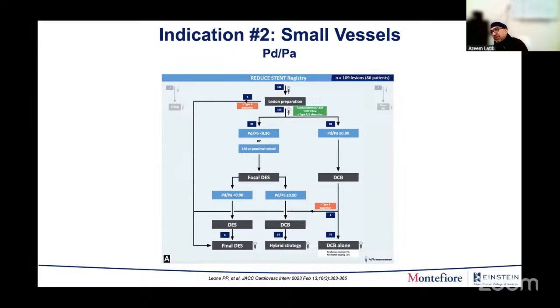The big challenge for us is it's hard to prove this because there are no animal models for calcified coronary arteries. I wish there were. So the only way to figure this out is on patients. And this may be when these balloons are approved. This would be a great study for one of our faculty or fellows, because we do so much imaging here: a small study on calcified lesions with imaging and drug-coated balloons to understand whether there are calcified lesions where drug-coated balloons work better than others.